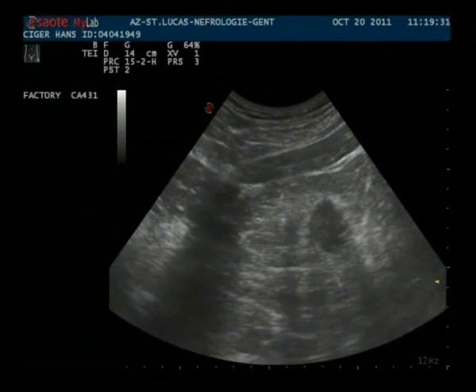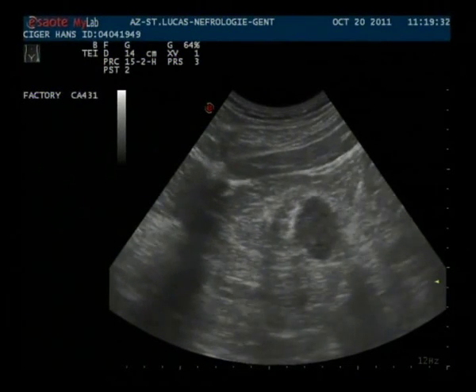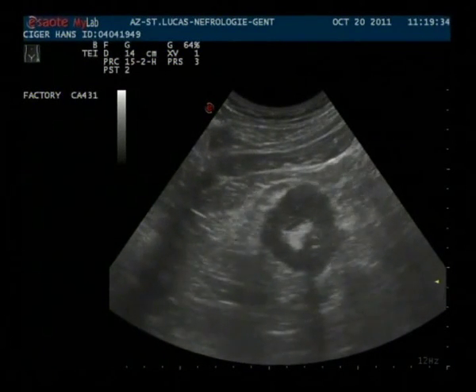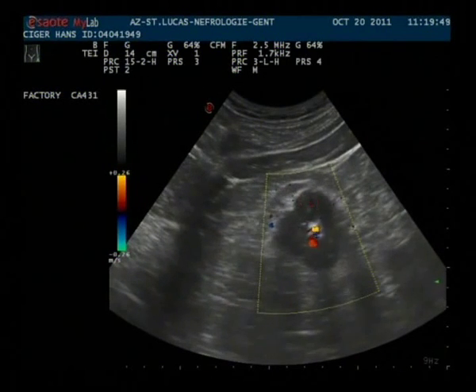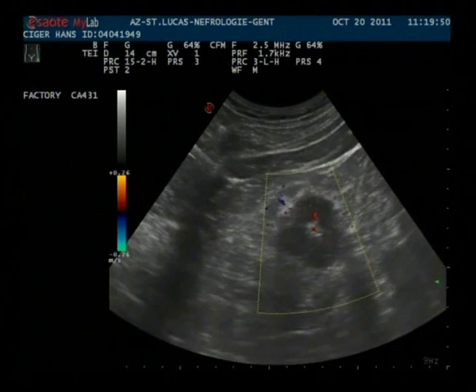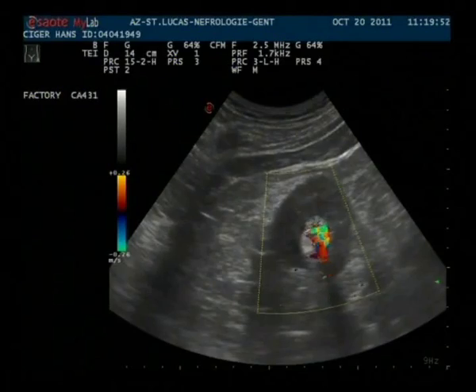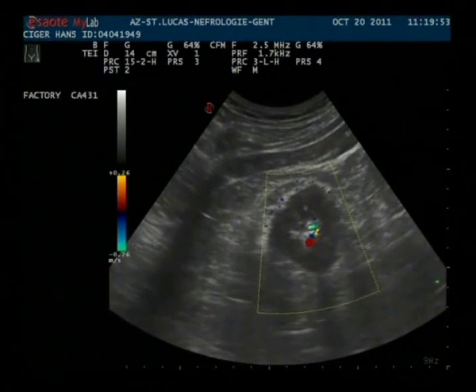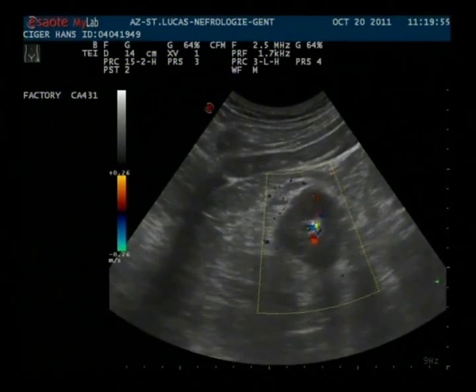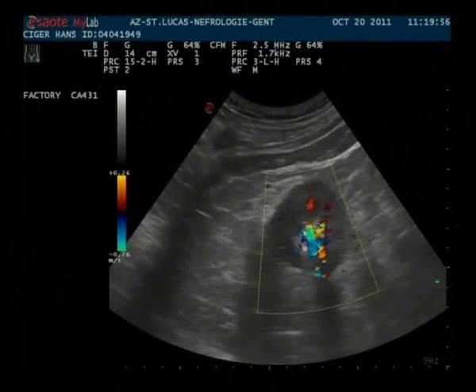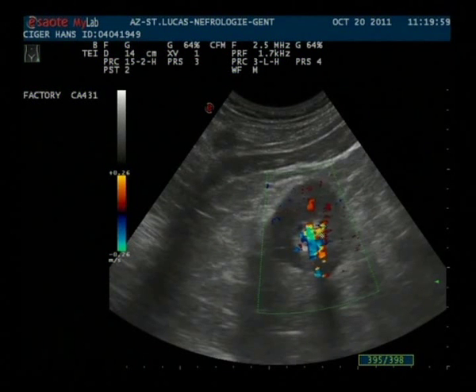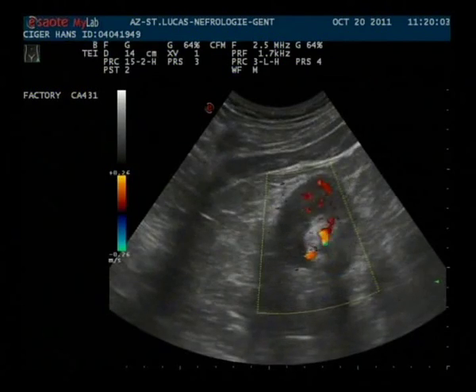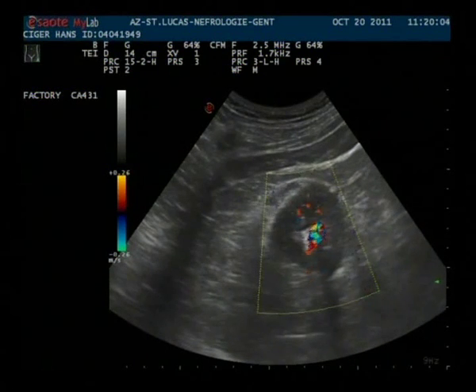Here we see a right kidney in transverse view, with in B-mode a kidney stone with retroacoustic shadowing. When we switch on the color Doppler, we see the typical twinkle artifact or color comet tail artifact. It is an artifact resulting from reflections from rough surfaces such as kidney stones.